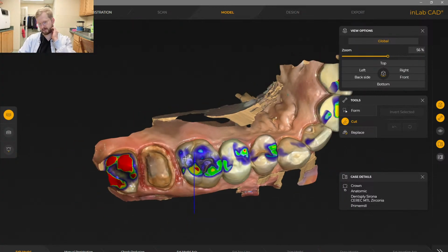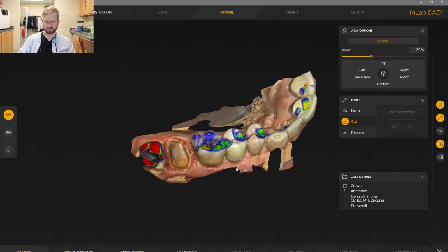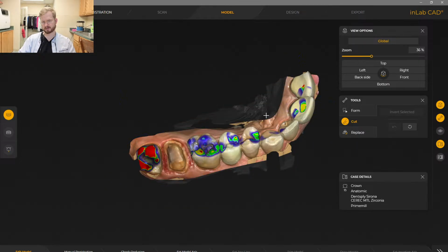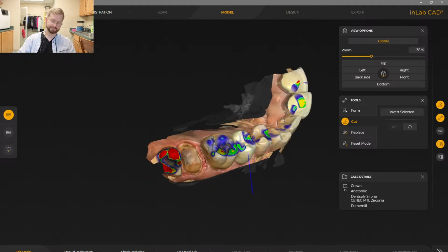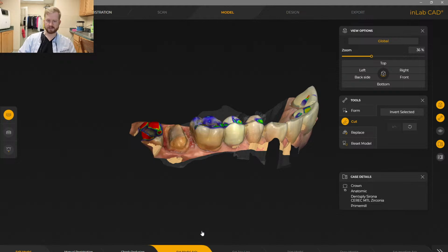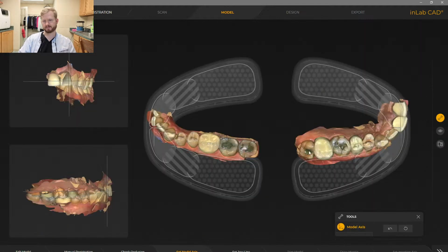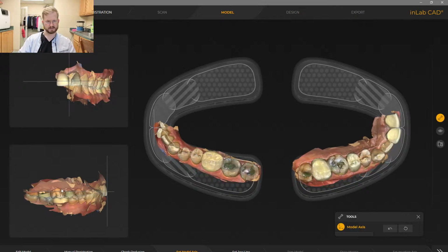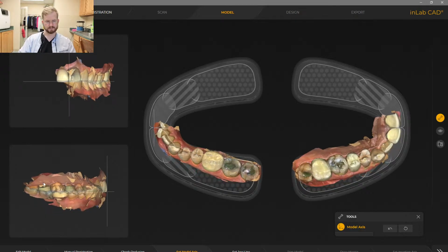There's our prep. I don't love prepping something that someone else has prepped before, just because usually I find things that I wouldn't have done to begin with, but that's okay. We'll work with what we have. Ended up turning out okay. Certainly better than it was.